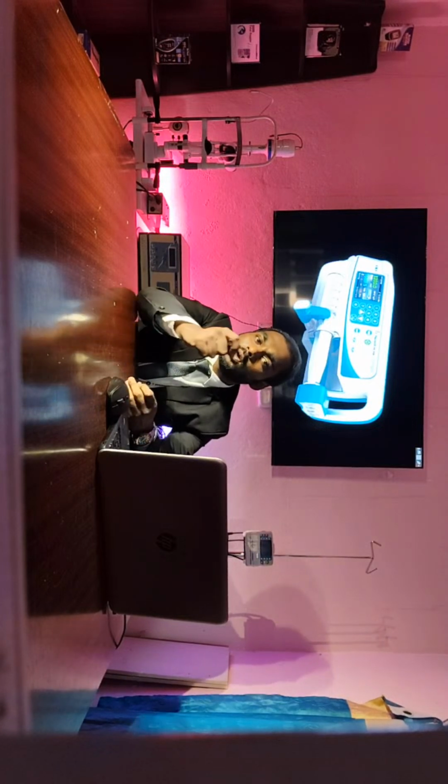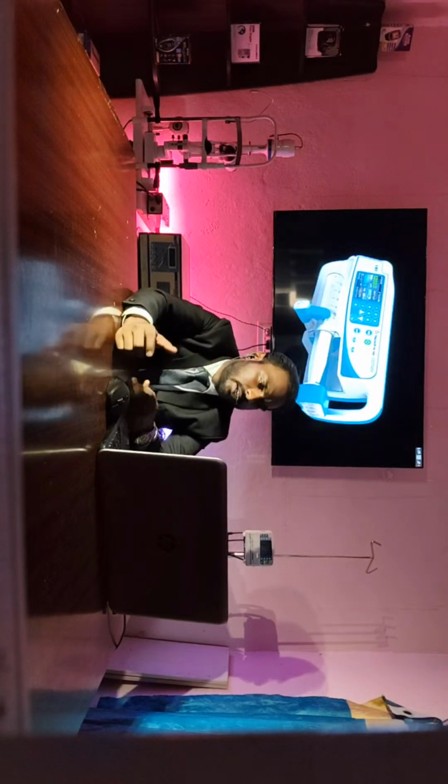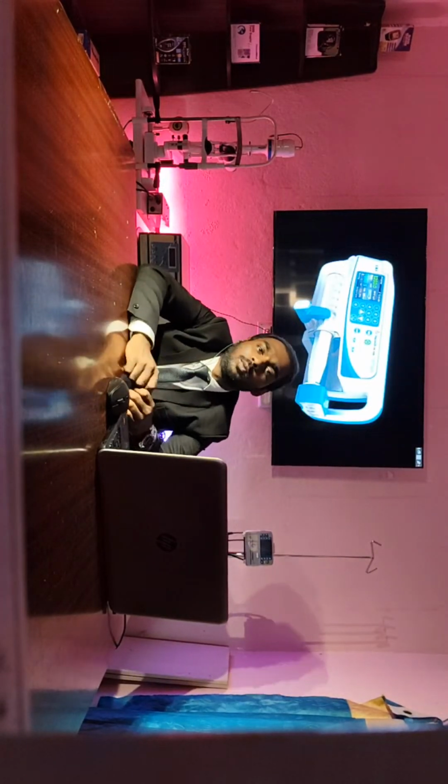So it can give that much accuracy compared to the infusion pump, because they use high dosages of medicines. It can give a low dosage also, but it needs to deliver the drug in a very precise manner. For example, if I fix a 10 ml syringe in this part and need to deliver this medicine to the patient over 10 hours, then for 1 hour only 1 ml will be delivered to the patient's body.